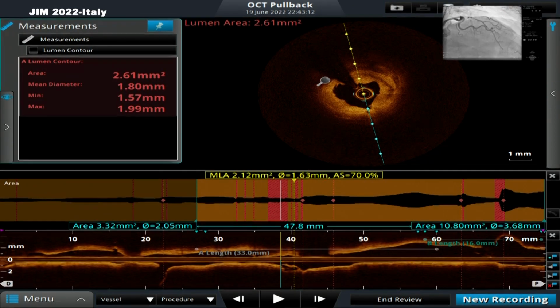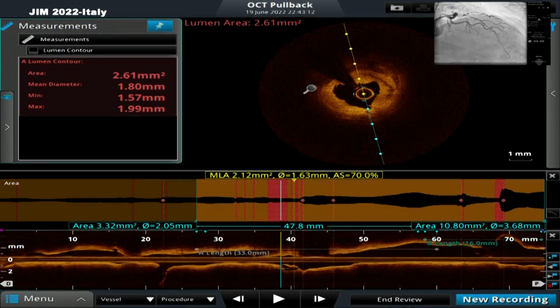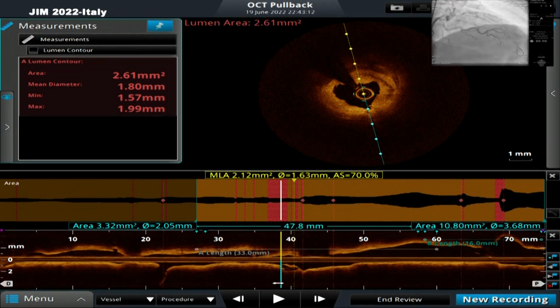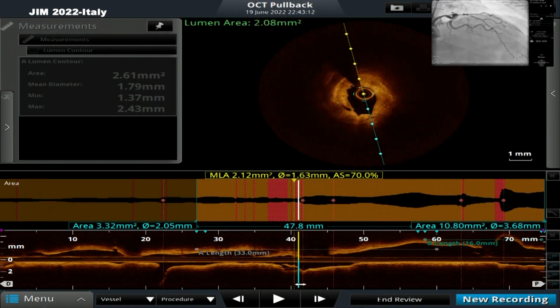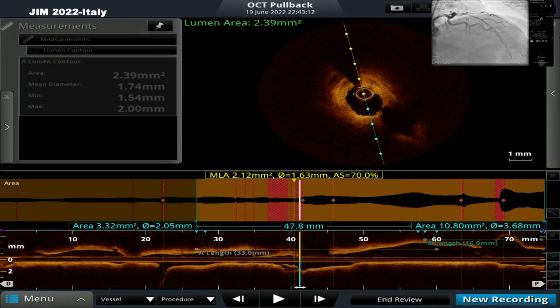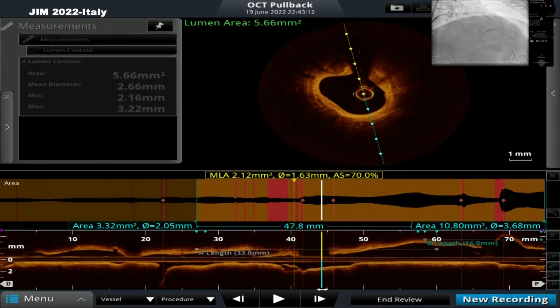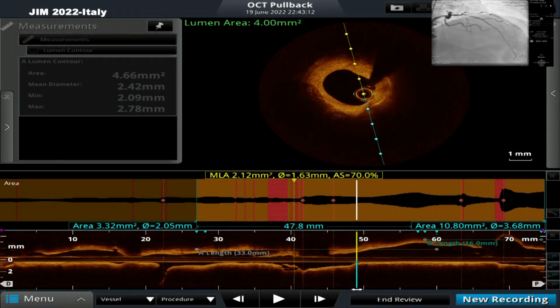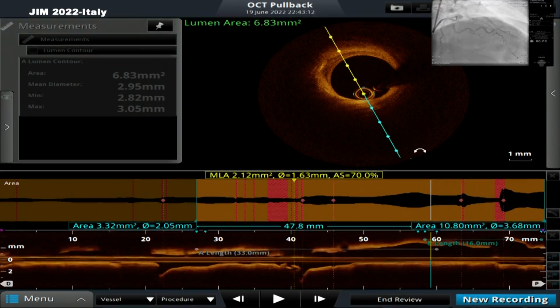In this particular area alone, you could see almost 180 degree arc of calcification. So that's the arc of calcification seen from 9 o'clock to 3 o'clock position. And as we further come proximally, it is more a fibrous lesion, and you could also see the area which was dilated, the dissected area with the help of the balloon. And as we come more proximally, again you could see areas of calcification. And as we come further more proximally, I'll come back to the ostium of the LAD.